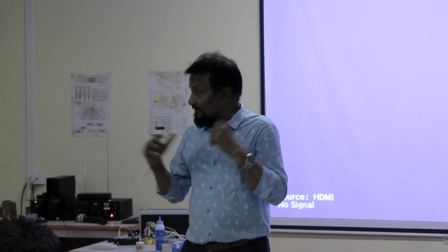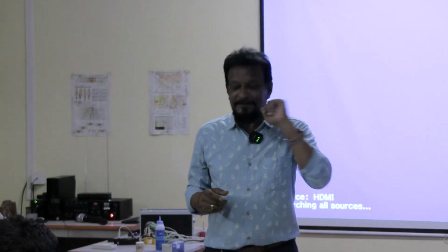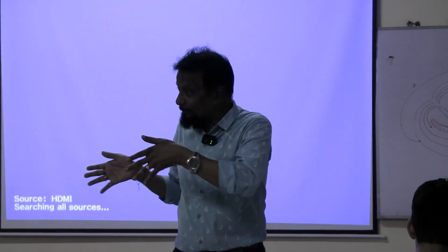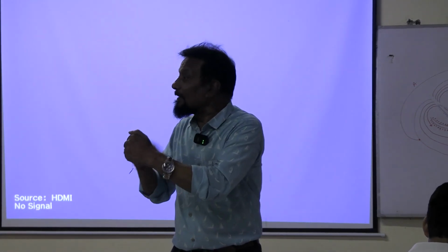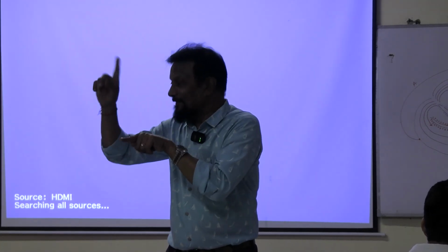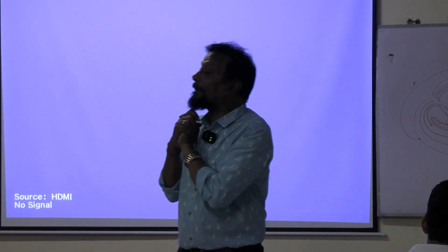You have heard the name of myocardial infarction. It happens in myocardial infarction. It happens in left bundle branch block. What is left bundle branch? Bundle of His is divided into right bundle and left bundle. If this left bundle is blocked, unable to transmit impulses, it is called left bundle branch block, and this will cause changes in the complex, changes in ST segment. So with that also you can diagnose.